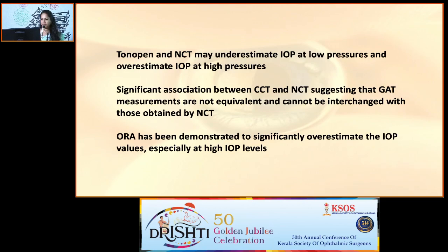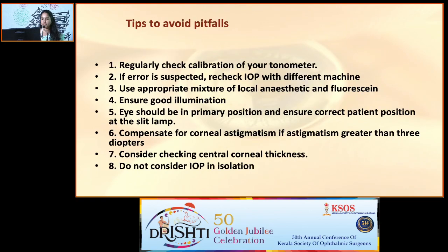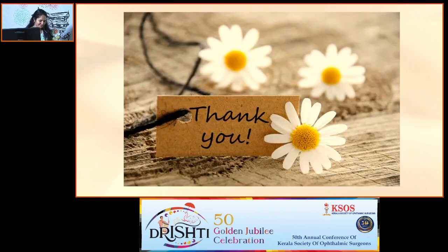normal pressures, excess, increased or lower IOPs. So, these are the tips to avoid pitfalls, and you take care of all these and you get a proper measurement of IOP. Thank you.